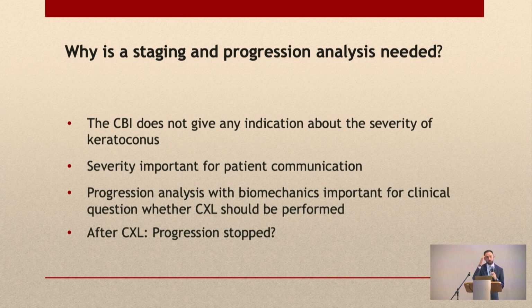And because if we use the CBI, as I explained before, we designed the CBI to change very rapidly from 0.2, which is normal, to 0.91, which is abnormal. So, that's the first take-home message. If you have a patient with a CBI of 0.3, and then you see the patient back in 1 month, and it is 0.4, it's not a progression. It's just random measurement. So you have to use other things that I will show you now to judge progression.